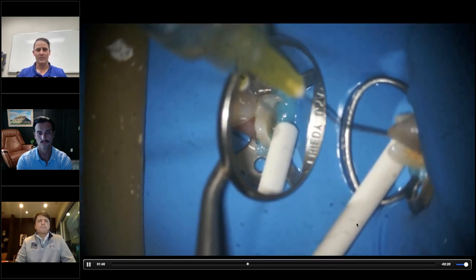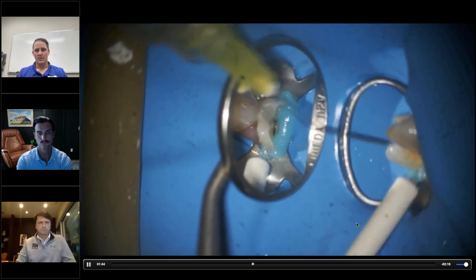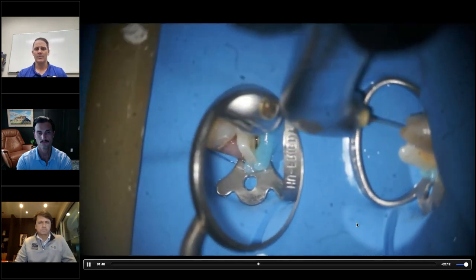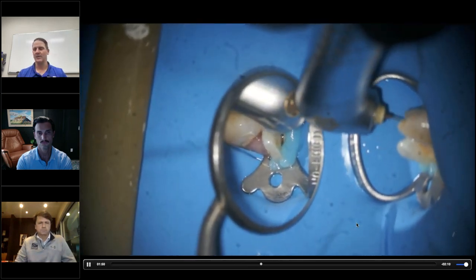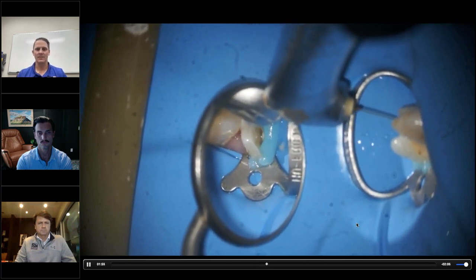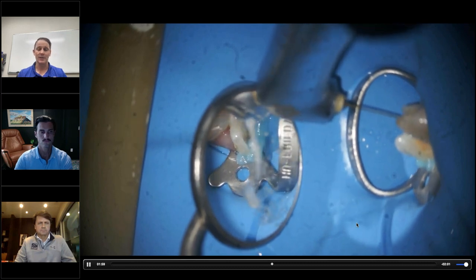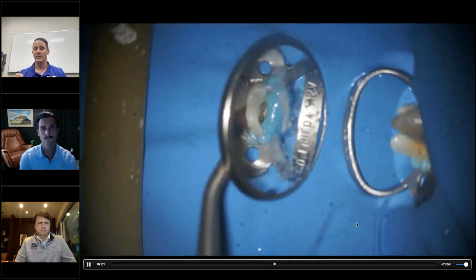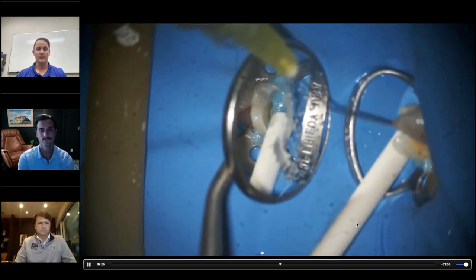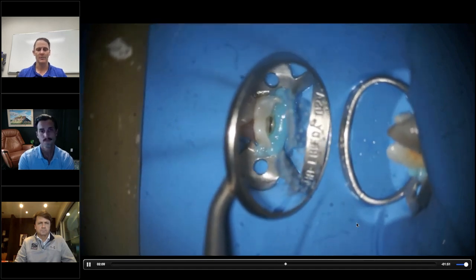Coming back again with solutions, same thing again. I think the recommendation is 3 times per canal. But again, some canals need more, some canals need less. Anyone that's done endo knows this. Some require a lot of instrumentation and irrigation, and others not nearly as much. But 3 is the starting point, and then you build from there.